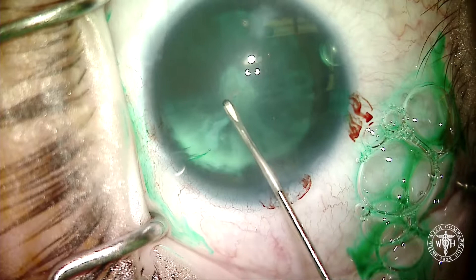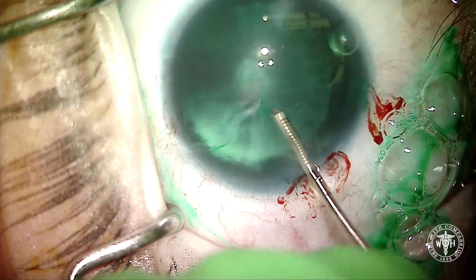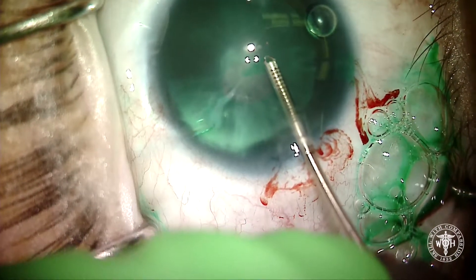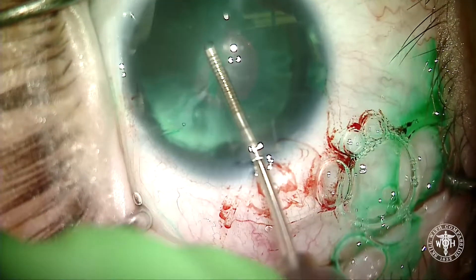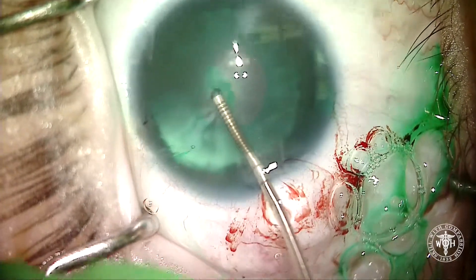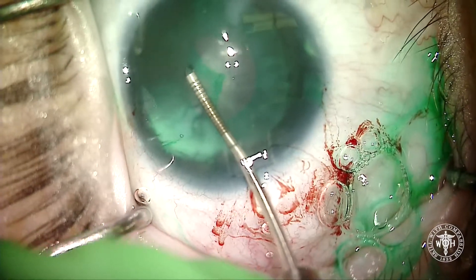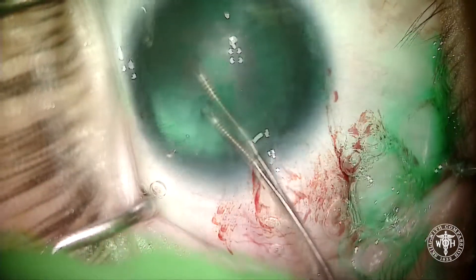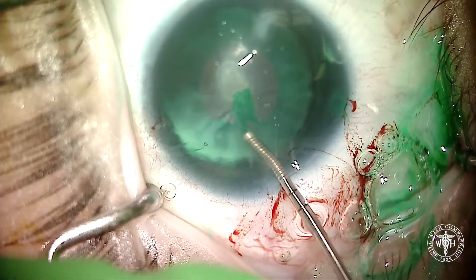We're going to carefully make our capsulorrhexis here. The capsulorrhexis forcep I'm using is a prototype made by Microsurgical Technology (MST). It has a very fine tip, and you can see the little gradations that help us measure how big the capsulorrhexis could be. Those very fine jaws allow you to see just at the very tip so you know exactly where you're grabbing. This capsulorrhexis was actually very challenging to tear, as it kept wanting to tear out — almost like an infantile or very pediatric-type cataract.